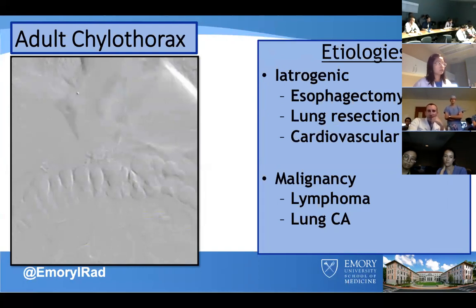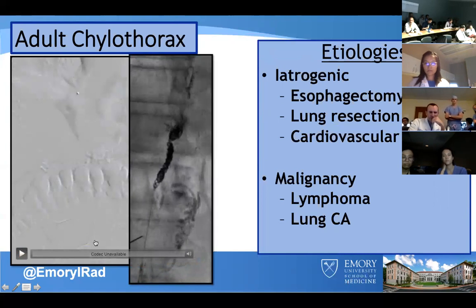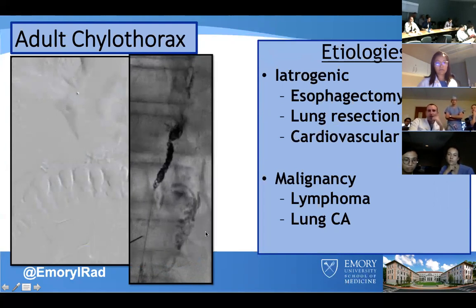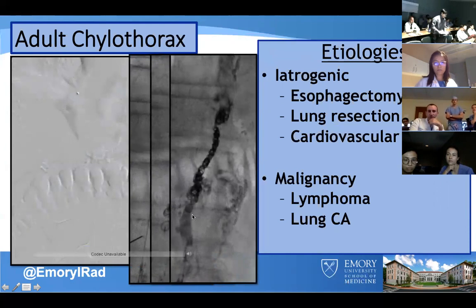But this is the same patient, and there was actually a leak here in the right lung base. A very flagrant leak in the right lung base on this lobectomy. We were able to get in with a 21 gauge needle past our wire, and then we placed a fairly dense coil pack extending down close to our access site. We then used some glue just to seal it shut and make sure that the spaces between the coils were completely closed.